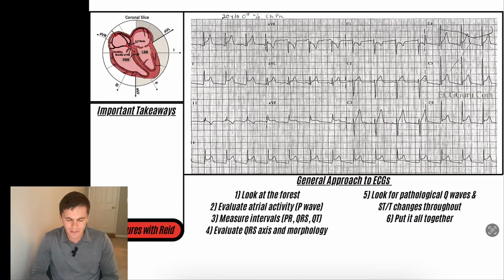So pericarditis. This is a difficult topic. It's a scary topic. It's often misdiagnosed in folks that are having a myocardial infarction and vice versa, because some of the ST changes that we see in pericarditis are going to be very similar to that of a myocardial infarction. But there are some key differences that we can talk through in today's lectures so that you can better understand the nuances of the diagnostics of EKG for pericarditis.